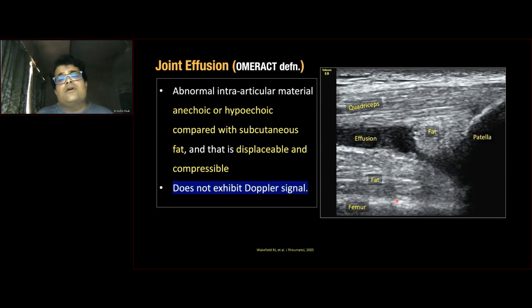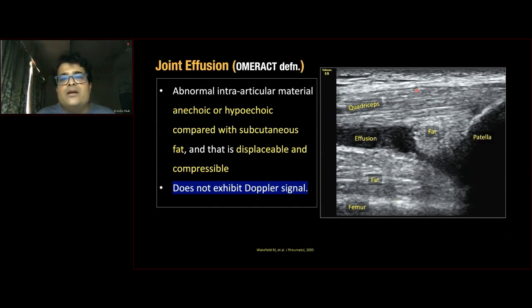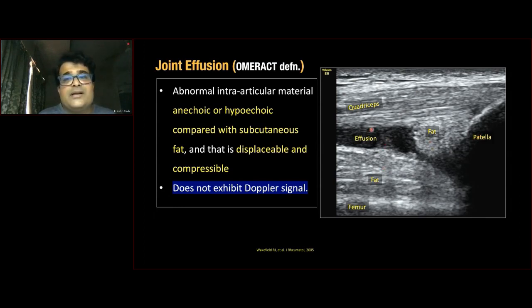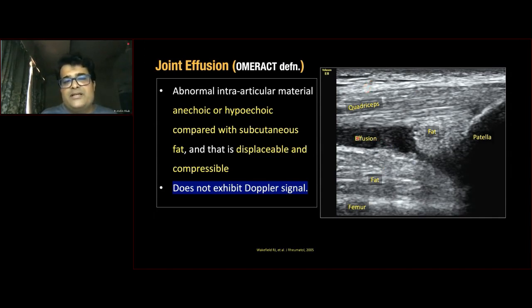The OMERACT definition of joint effusion: any abnormal intra-articular material that is anechoic or hypoechoic compared with subcutaneous fat, which is displaceable or compressible, and does not exhibit Doppler signal. Shown here is effusion within the suprapatellar recess — the patella, suprapatellar fat, pre-femoral fat, and anechoic effusion that is less echogenic than subcutaneous fat and is displaceable and compressible.